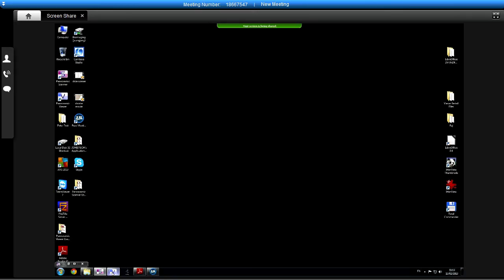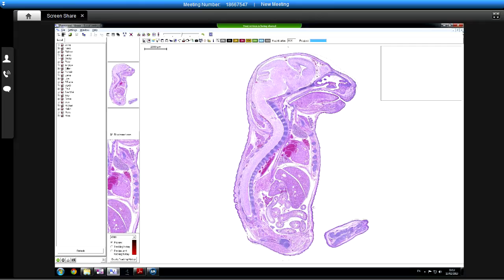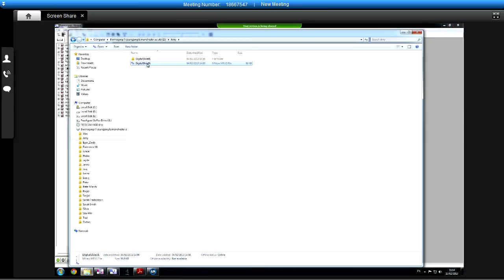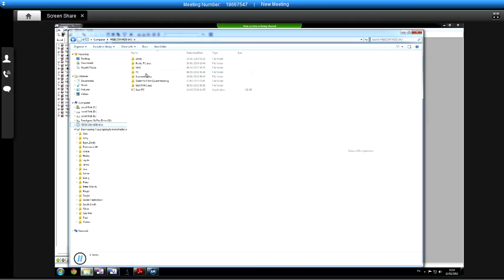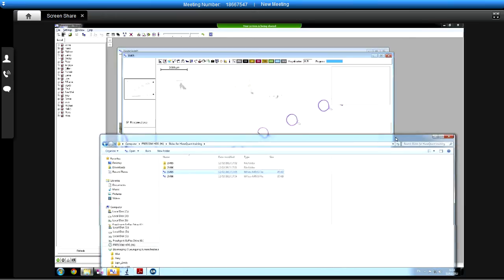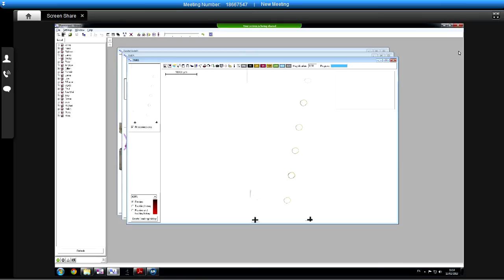Let's tell you what, just tell me a little bit about each one. So, first of all, this is one of Amy's, and then yours is here. Whereabouts in here are they? In the slide. That one there. There's two different things. Yeah, so that's one of them. The other one. That's the other one. Okay, so just briefly, what's the interesting stuff in here? Some of them look great. I'll just choose on my own.